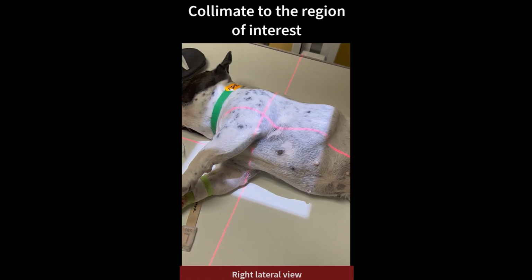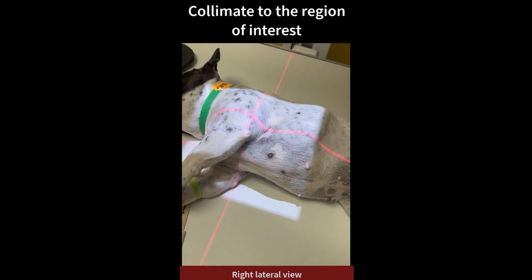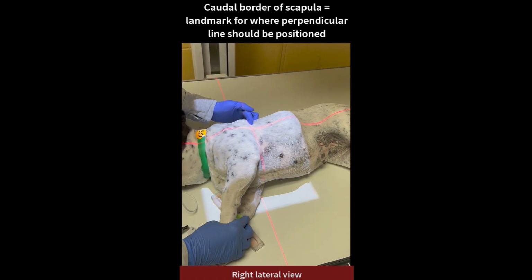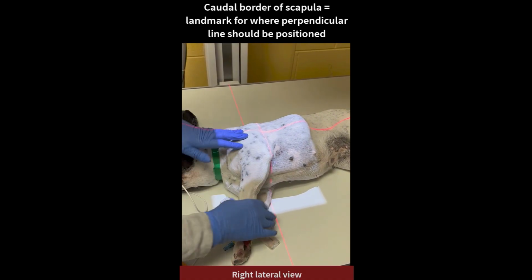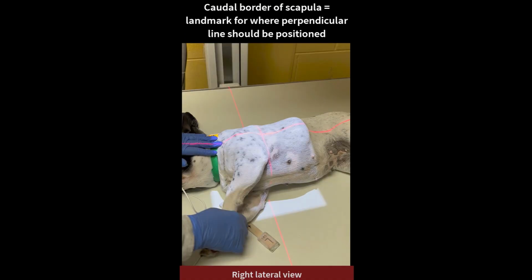Next, collimate to the region of interest. In this right lateral view, the perpendicular line, extending in a dorsal to ventral direction, is positioned roughly at the caudal border of the scapula. The cranial aspect of the field of view should extend cranial to the thoracic inlet, with the caudal aspect including the 12th or 13th rib.